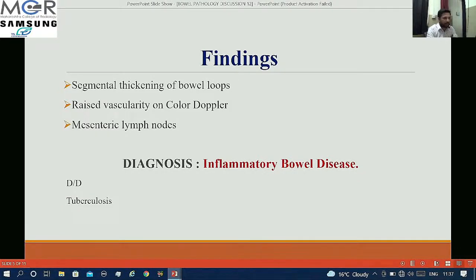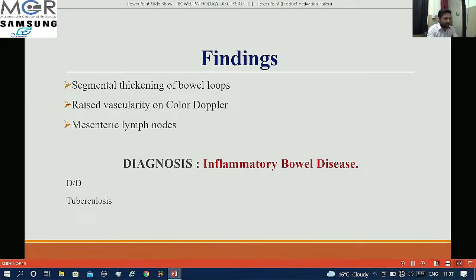The difference between tuberculosis and inflammatory bowel disease is: in inflammatory bowel disease we get segmental bowel thickening whereas the rest of the bowel loops will show preserved gut signature, whereas in tuberculosis we will get intramural bowel thickening with loss of gut signature.